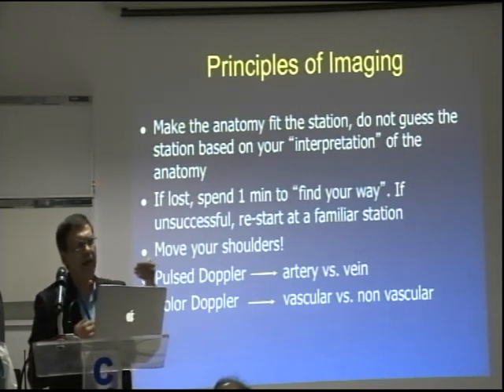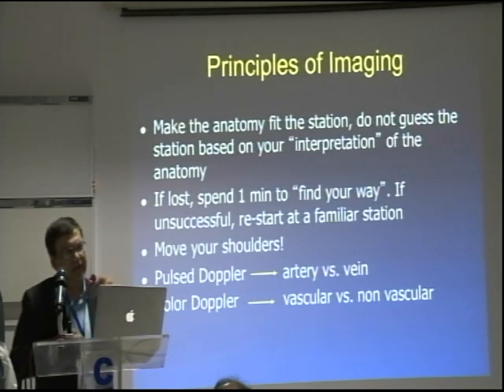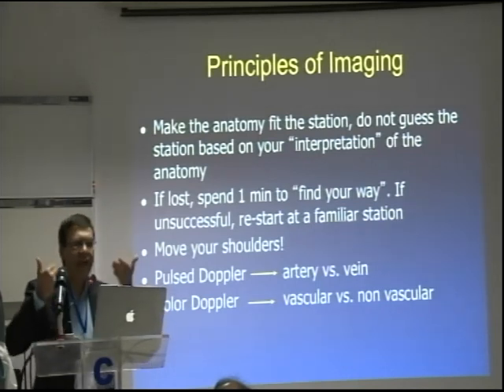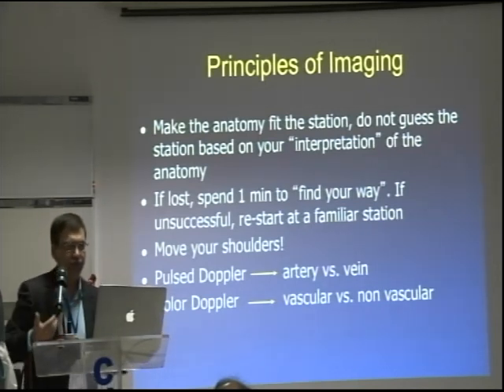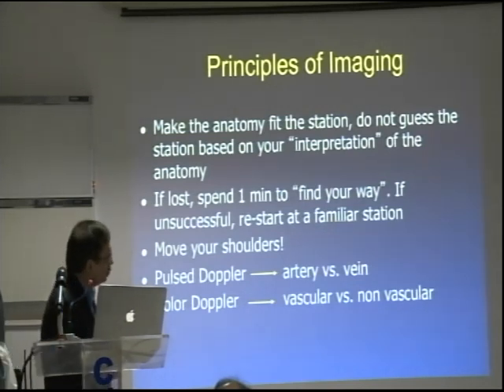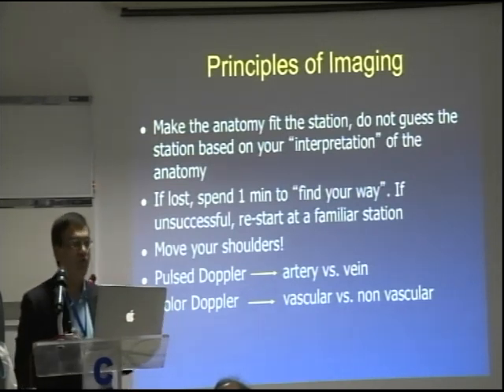But the scope, as Mustafa mentioned, has to be a really, really straight scope. A person like Dr. Gyas or Dr. Saad or Dr. Wakar, who are tall, can lift the scope and the scope will still be straight. But if you are short like me, move away from the patient, and I'll show you that. That would keep the scope straight. And use your wrist, use your shoulders, because the transducer has to be moving, okay?